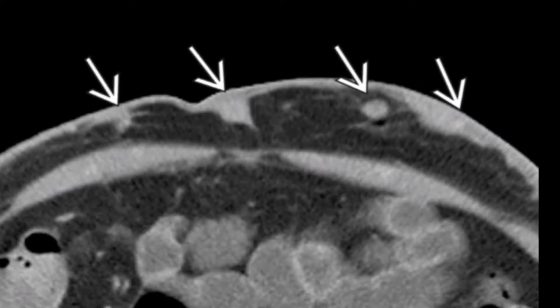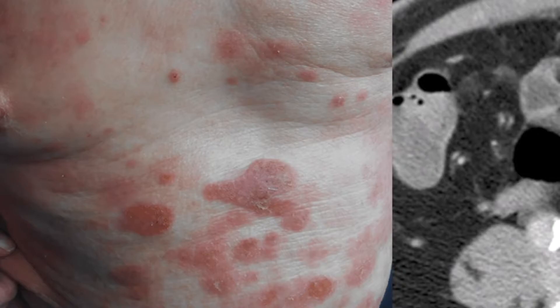Axial contrast-enhanced CT shows irregular subcutaneous nodules and skin thickening along the anterior abdominal wall. These findings were clinically apparent as purple plaques and ulcerated masses.